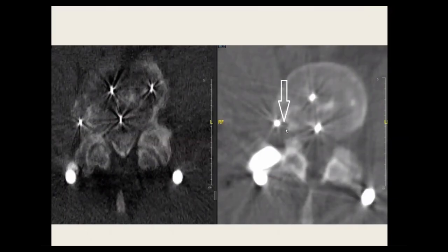One of the advantages of using navigation for this case was that I have intraoperative CT. So you can see on the pre-op, we see the cage and the heterotopic bone, but on the intraoperative, postoperative CT, we can see how I've reestablished the foramen completely open, and the patient had immediate relief from his symptoms.